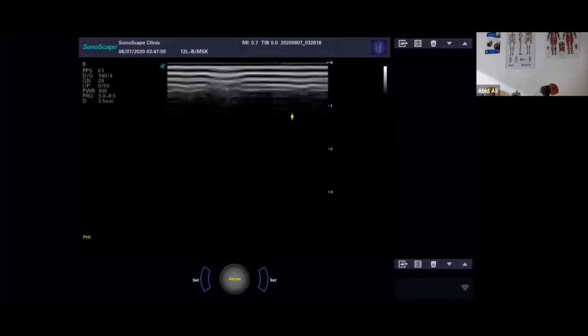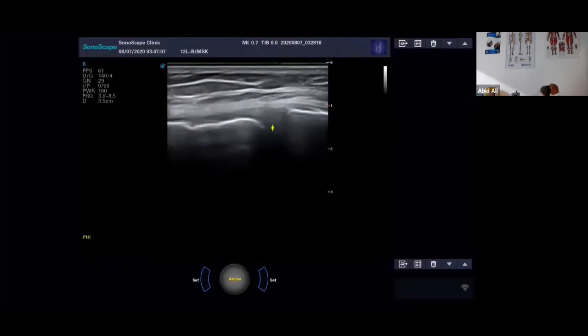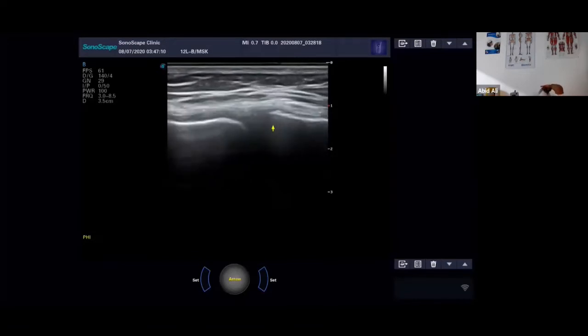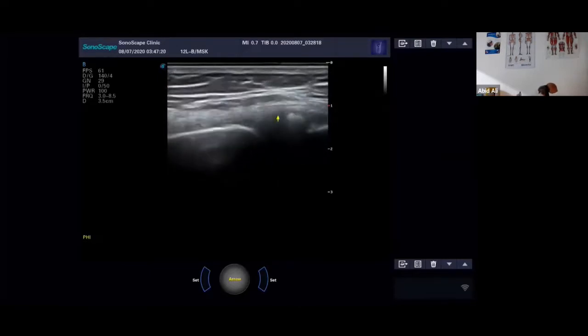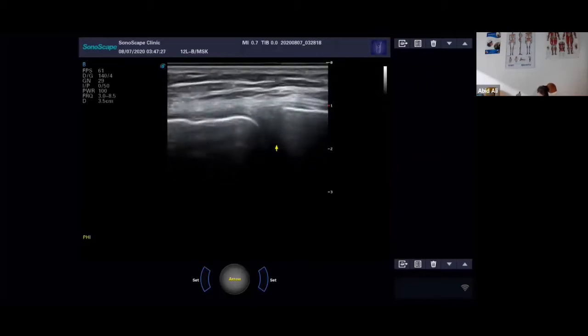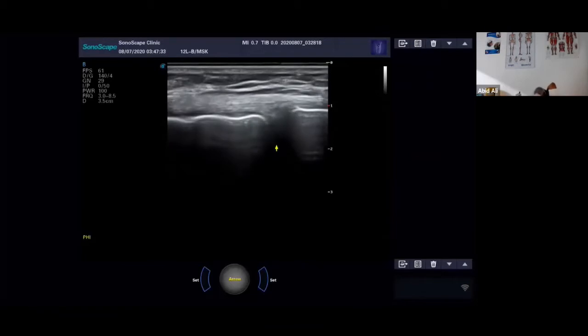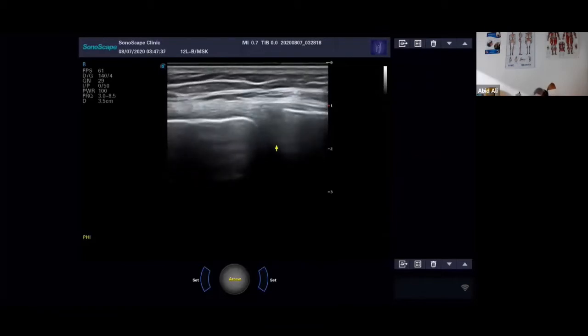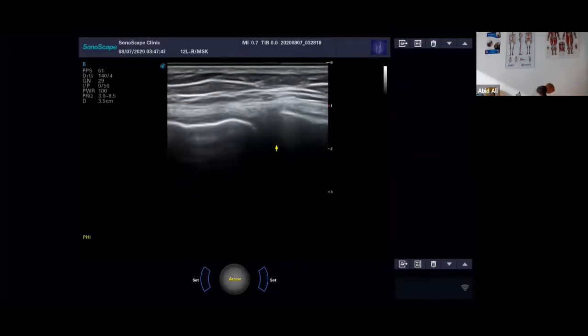And do you want to put colour flow Doppler onto there? Yeah, you can do. What are you looking for then? Well, would you expect to see blood flow to the meniscus? I don't think so. If it was really hypervascular, I'd probably say there's some sort of synovitis going on. Yes. Yeah. And you do see that fairly commonly. A lot of rheumatoid things. Yeah. A bit like a Christmas tree in there. Yeah, they do. But you have to just be aware of your settings.